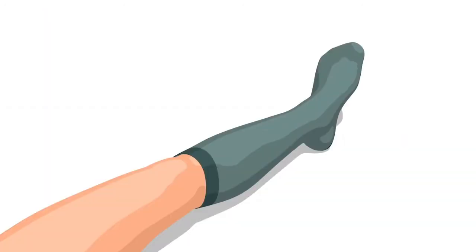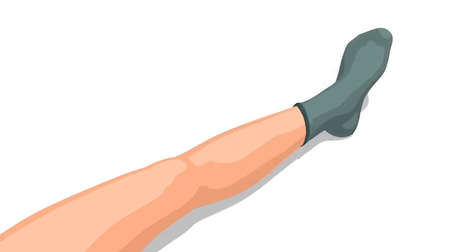If the patient is small with a short distance between the ankle and the knee, place the stocking on the calf without any stretch at all. If the patient is tall, as you go up from the ankle, put stretch into the stocking and pull up using a zigzag action to get it to the correct height. But don't overstretch. If you've not got up to knee height, go back down to the ankle and put more stretch in.